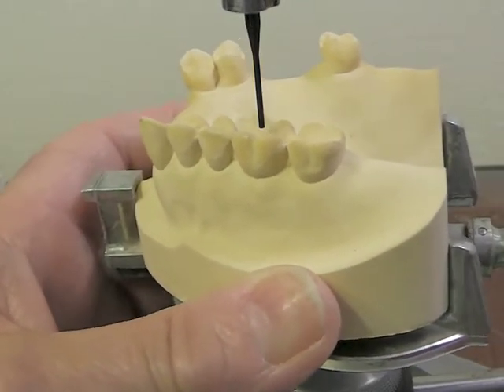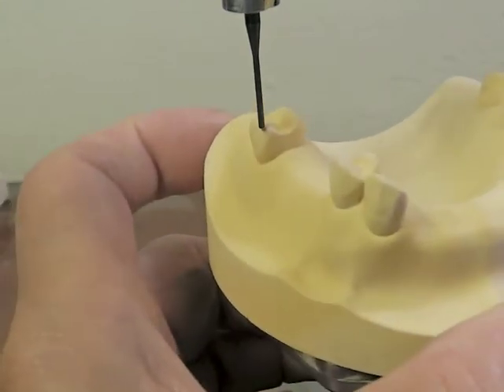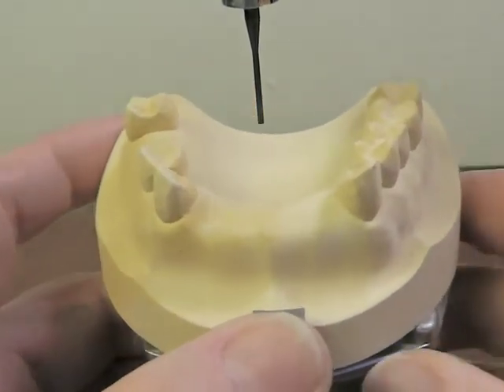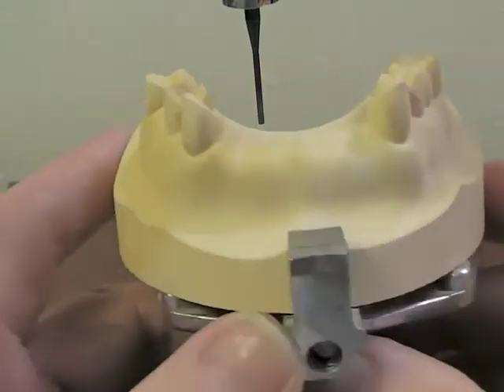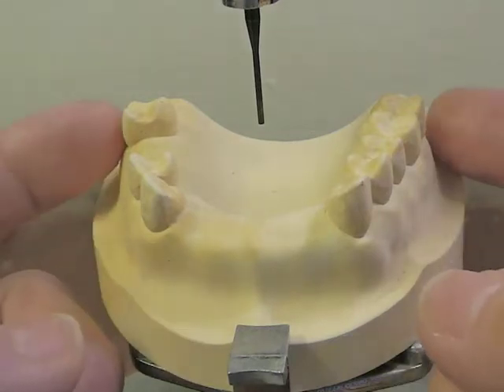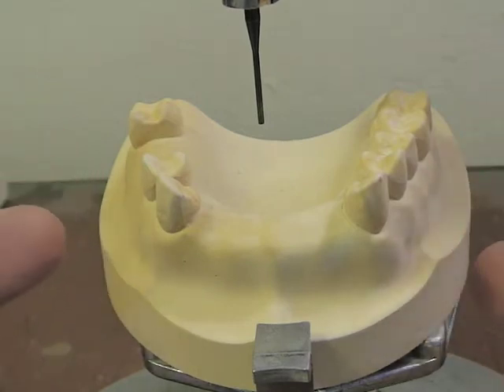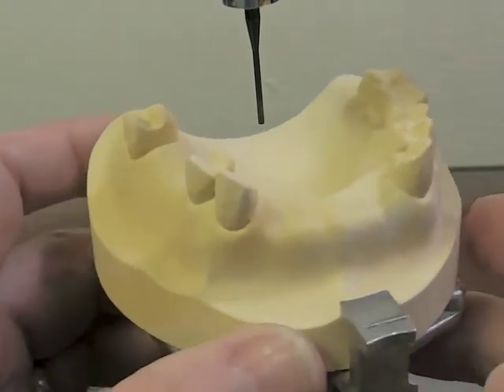This plane of occlusion on this cast has a curvature, and it's a little bit difficult to say that it's going to be perfect, but I can get some of my casts lined up to where that plane is relatively parallel to the floor. You also want to look from the facial surfaces and see that you have approximately the same type of crest of curvature and undercuts on each side. But then you get down to brass tacks.